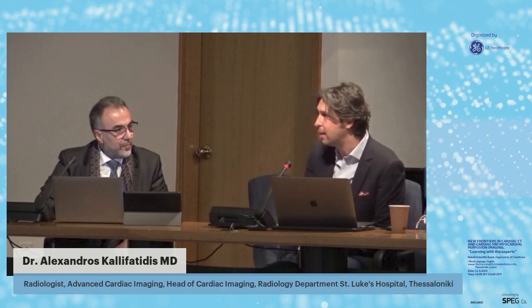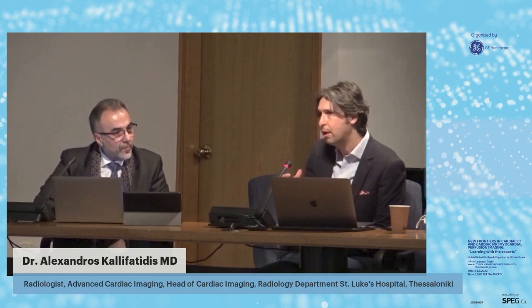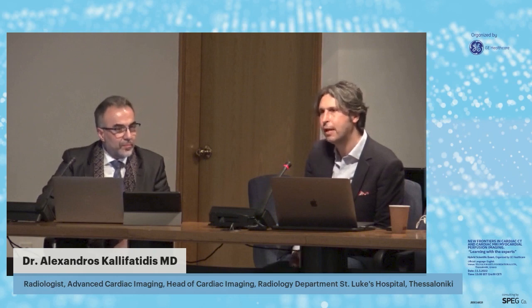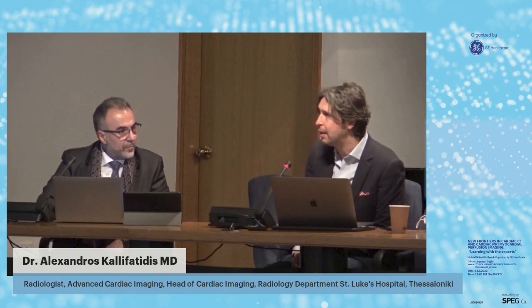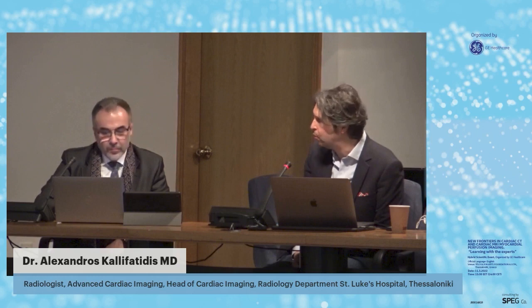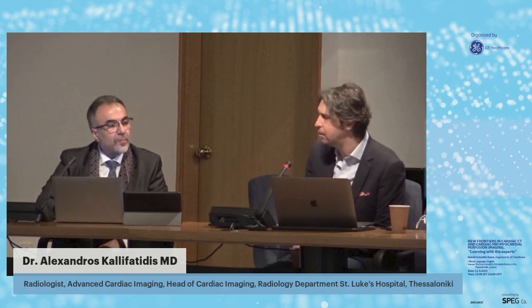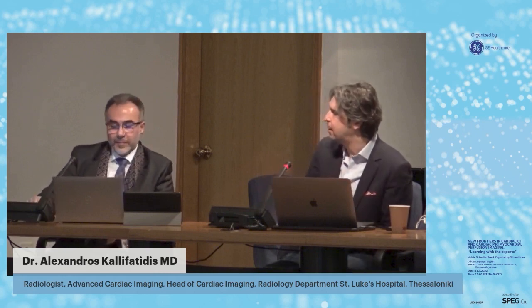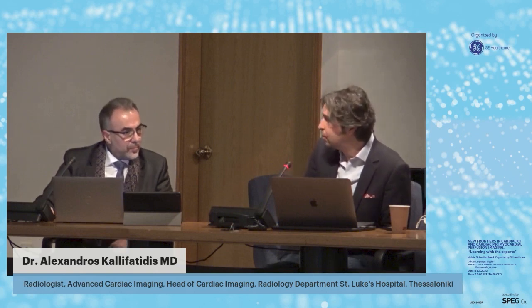The advantage of 3 Tesla is the perfusion sequence. It could be better, but for the clinical assessment, it doesn't add any significant improvement for the diagnosis. One tip is that in 3 Tesla, maybe we can use the gradient echo sequence much more easily and not the SSFP that we widely use now in 1.5. This is in order to avoid the artifacts from SSFP, so we don't have to proceed with shimming, etc. And usually for 3 Tesla, the most appropriate sequence is gradient echo.